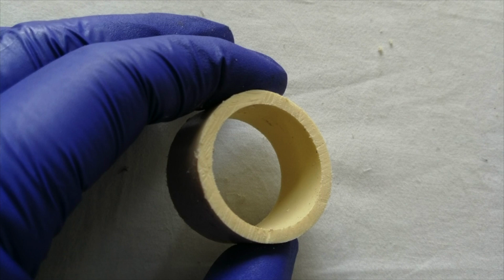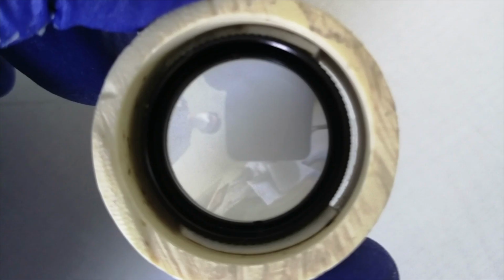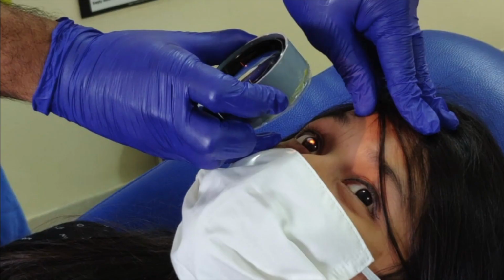A 90D can also be modified in a similar way using a 1-inch CPVC pipe, the only point of difference being that instead of putting 2 double-sided tapes one over the other, only a single layer of tape would suffice. Another modification is using a cling wrap to cover the 78 diopter lens, which will be described later in the video. Now coming to the safe practices during an IDO examination.